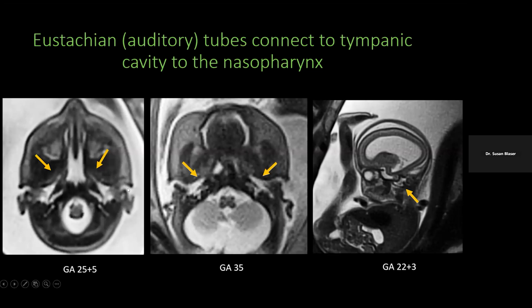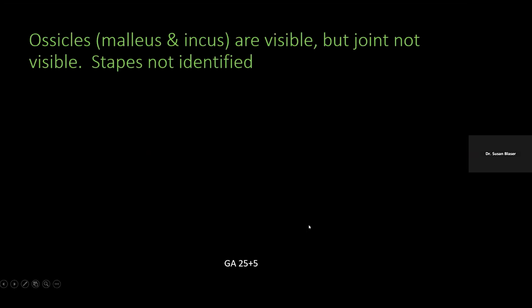Here happens to be, as far as you're going to be able to see on this one, the external auditory canal. Remember that it's curved shaped. You're not going to always get it on the same view. Here's a tympanic recess. You see it a little bit differently on this particular 35-weeker. Again, your S-shaped EAM. There is your eustachian tube extending inward. And again, your S-shaped pinna, not so S-shaped yet at that particular time, but very well developed on your 35-weeker.